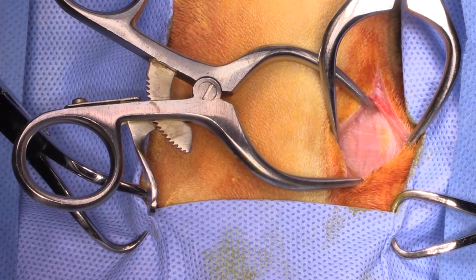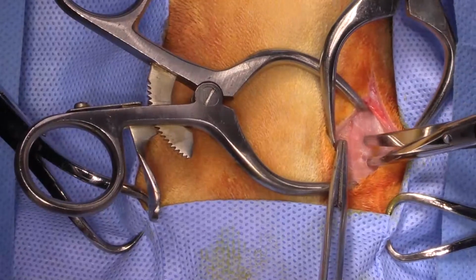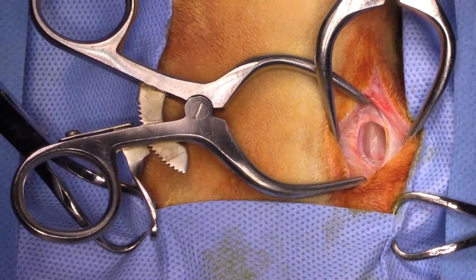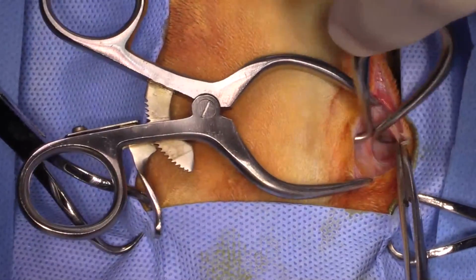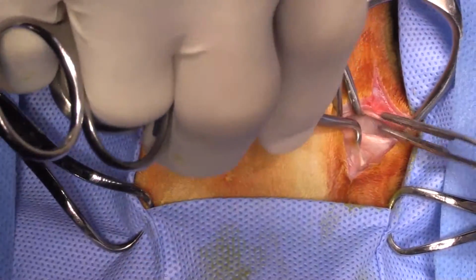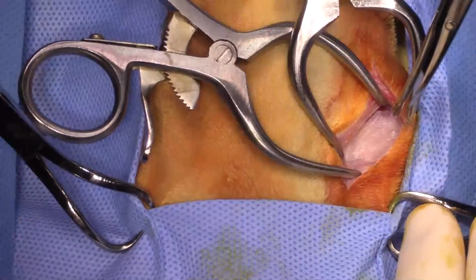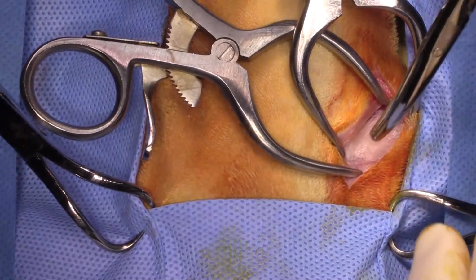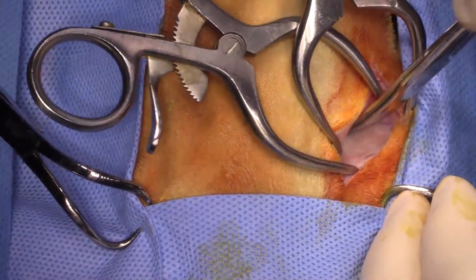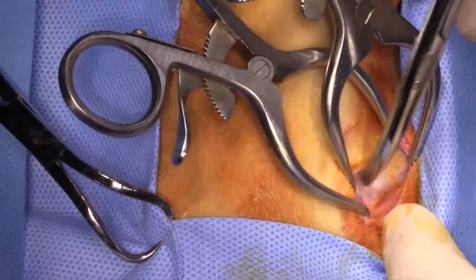So where is our Metzenbaum scissor? And Gelpi retractors are critical here. You're not going to get away without them. And I just basically keep dissecting down. There's the linguofacial vein poking out right there, so we'll have to just be aware of that. A little bit of parotid salivary gland sticking out there as well. And I just keep palpating down onto the bulla.